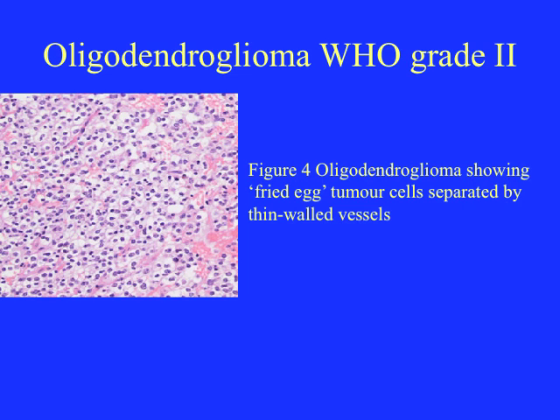This is an image of an oligodendroglioma WHO grade 2 — an anaplastic oligodendroglioma WHO grade 3 also exists but is not shown here. This is the typical histology: fried egg tumour cells separated by thin-walled blood vessels. These fried egg tumour cells are actually negative for GFAP, and the clear cytoplasm is just a retraction artefact characteristic of the oligodendroglial lineage.